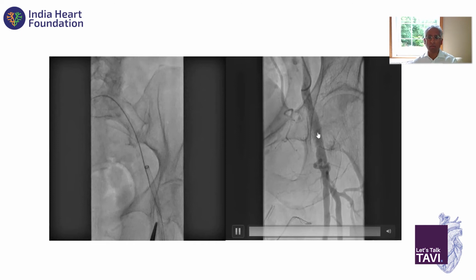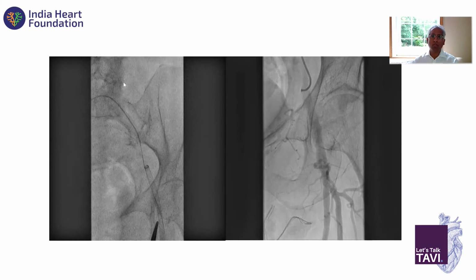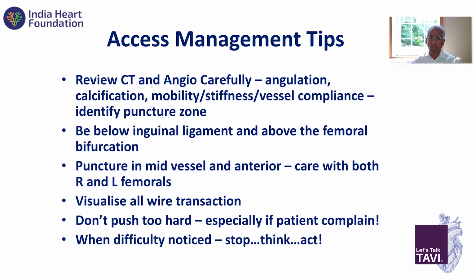But on ultrasound, that was a dissected plane with no luminal issue, no leak. So we left it. Most of these healed themselves. So then to conclude, I think it's really, really important, as we've all mentioned, to review your CT, look at it yourself. Don't just listen to what the radiologists tell you.